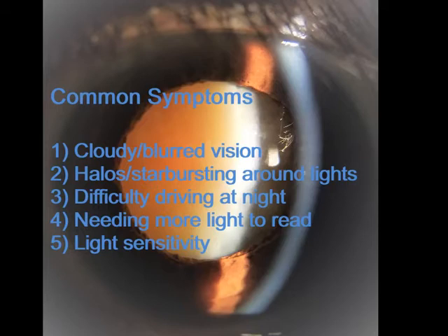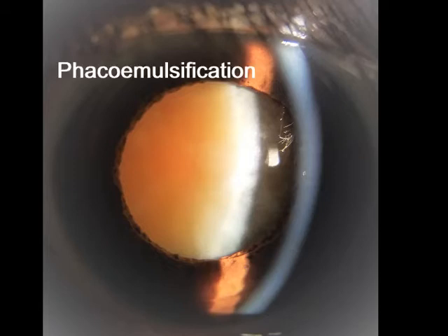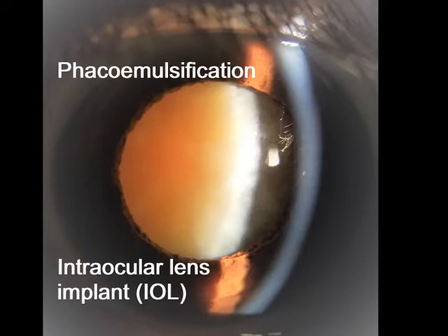In this video of one of my routine cataract surgeries, you will see me using an instrument that breaks up and removes your old lens material called phacoemulsification, and then you will see me insert an intraocular lens implant, or IOL, that is about 6 millimeters in diameter. I tell my patients that cataract surgery is a remove and replace procedure.